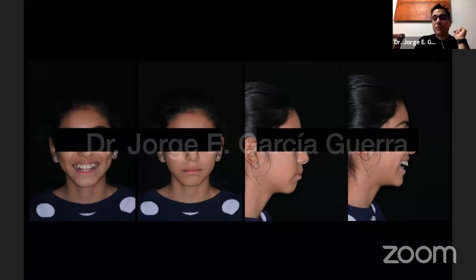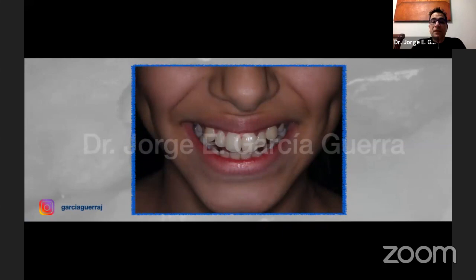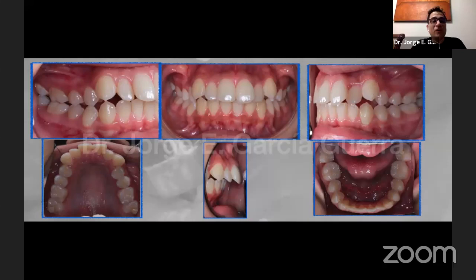Now in this case, normally I don't like to indicate extractions, but we must do a correct analysis of the face of the patient and of the bite. And sometimes, like with this patient, where we have larger teeth and protruded teeth, we do extraction of the bicuspids. You can see her smile, she didn't close her lips very well. It was a borderline class two molar, but because of the size of the teeth and facial features, we indicated in this case extraction of the upper first bicuspids.